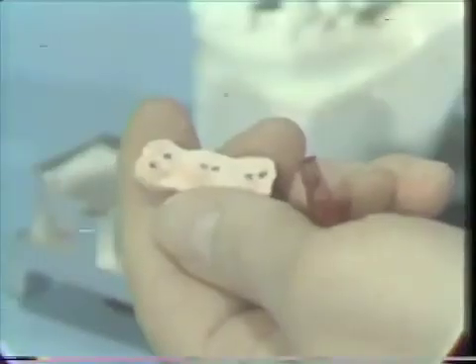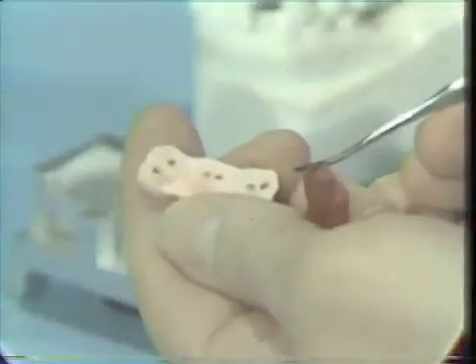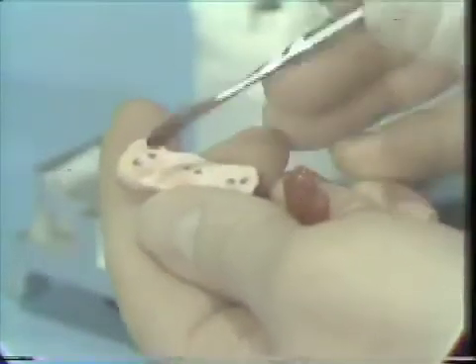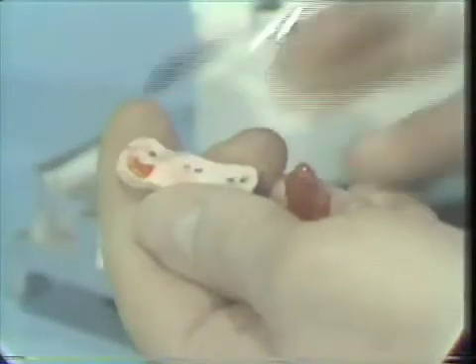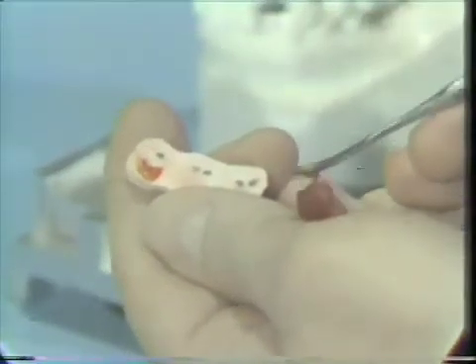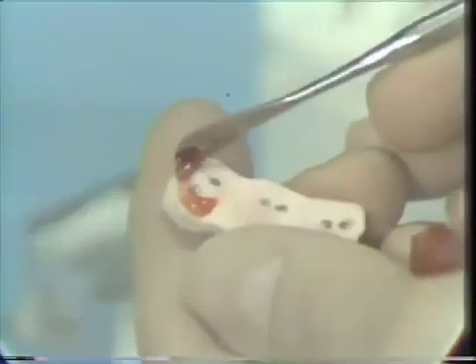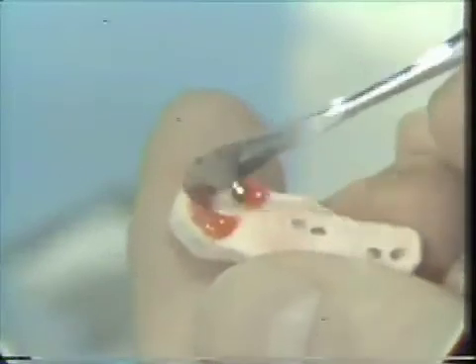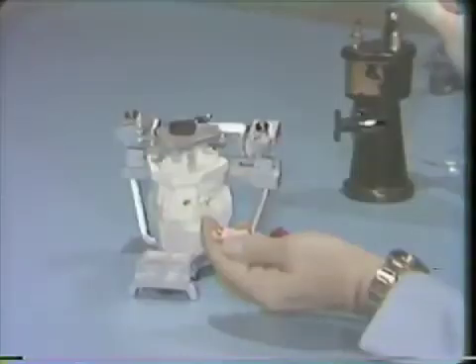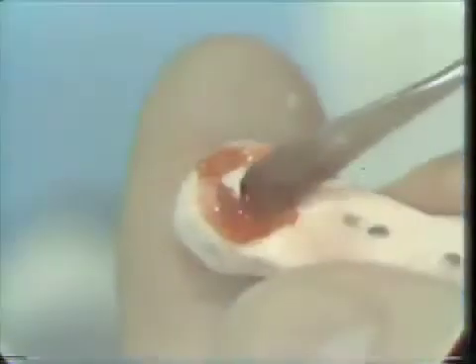We will be applying the wax primarily to the periphery of the platform, inasmuch as this is where the wax is normally pushed during the functionally generated registration. After one has done several of these, we can pretty well gauge where the wax will be moved to, and by putting the bulk of the wax in these areas, it does save some time and generate a better registration.